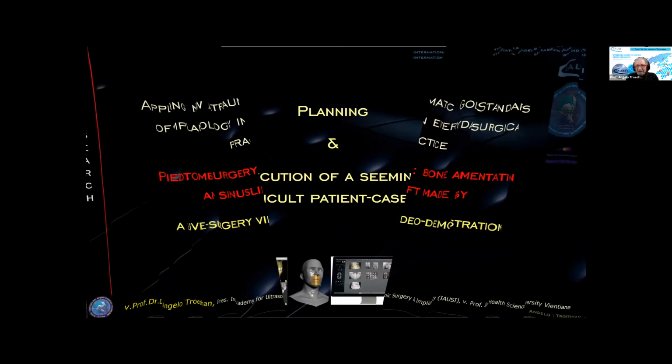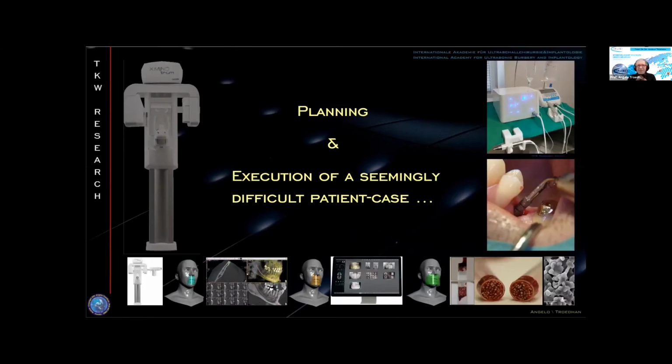Before we start with the surgery, of course, nowadays we need a proper planning. Until 2010, 2011, CBCT technology was not that advanced. The pictures were blurry, the pictures contained a lot of artifacts, and the devices to take CBCTs have been extremely expensive. So only highly specialized clinics and chains of dentistry studios were able to afford CBCT scanners.